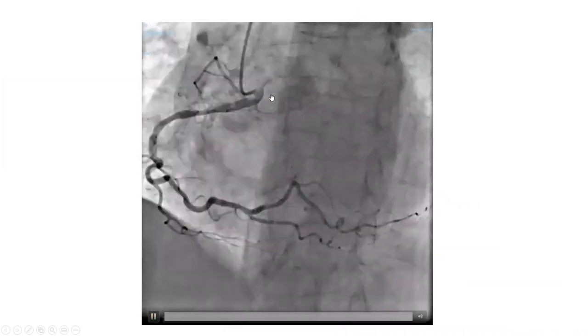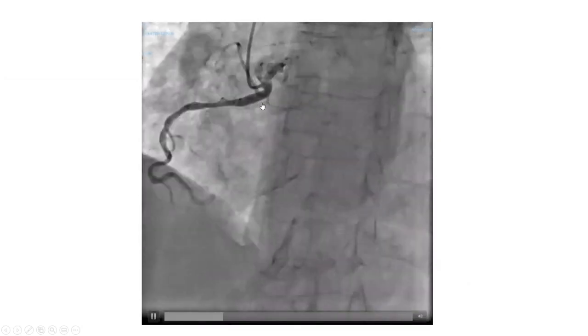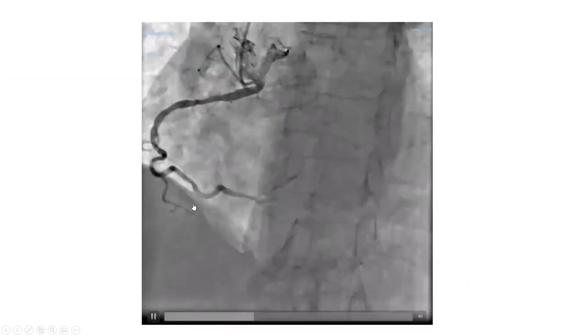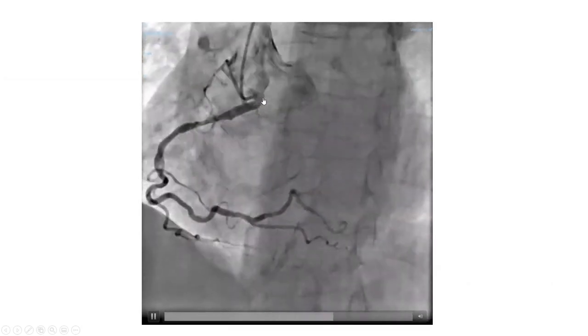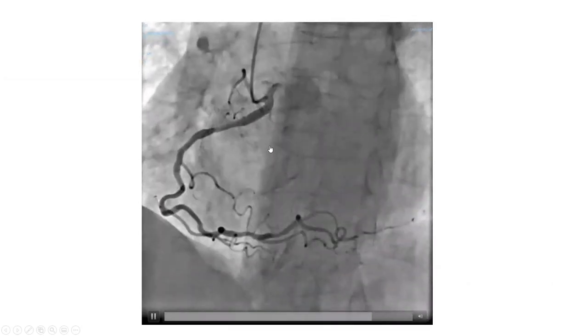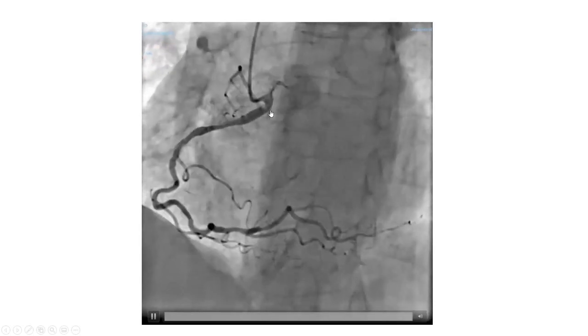Here's another illustration to embed it in your brain. When you look at a coronary angiogram and see the catheter looking at you in LAO view — that ostium is looking at you — you need to recognize this is an anterior RCA takeoff. An RAO view will prove it: the catheter will be pointing anteriorly. Recognize a catheter looking at you in LAO — this is anterior takeoff.